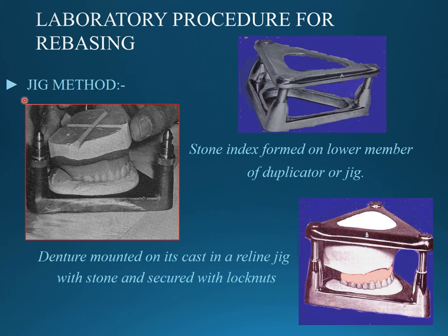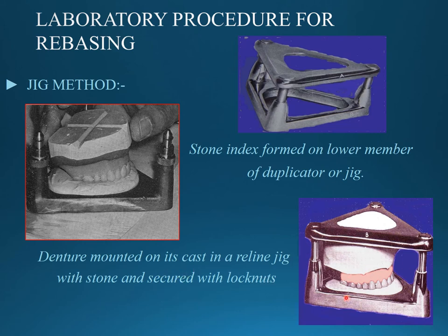Coming to the lab procedure for rebasing — the jig method: a stone index is formed in the lower member by embedding the denture in impression plaster. The cast and denture are placed in a jig (duplicator) and secured by a bolt so it does not move.